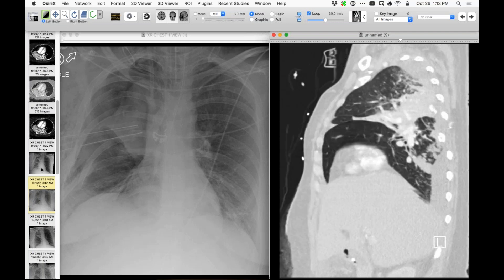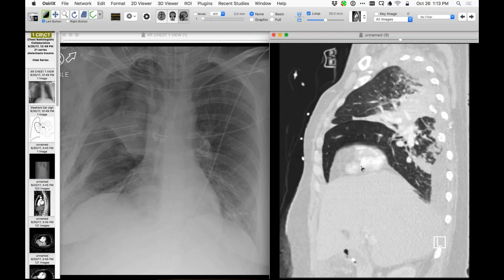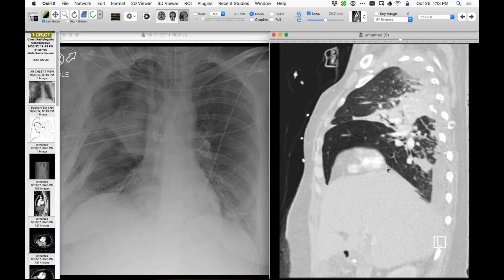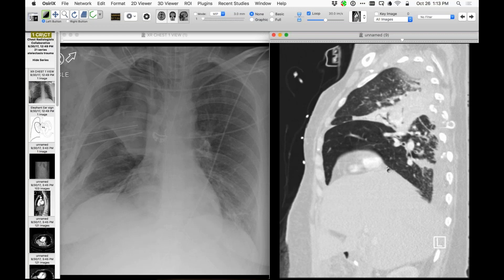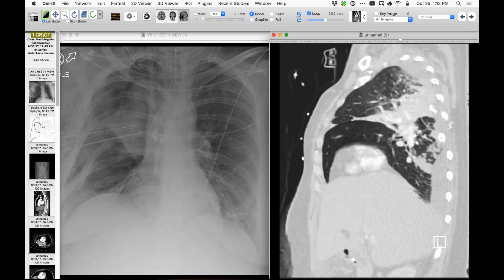I think these are the interlobar fissures. Going forward in time, if you think about where the fissures are, we have one fissure here and one fissure up here. Here's the lower lobe — this is a major fissure that goes like this, whereas this one up here is the minor fissure. At that time, we have a combination of two fissures — between the overexpanded right lower lobe and the atelectatic right middle and atelectatic right upper is what I'm trying to postulate here.